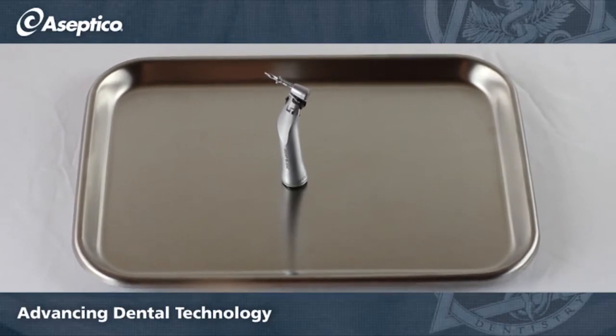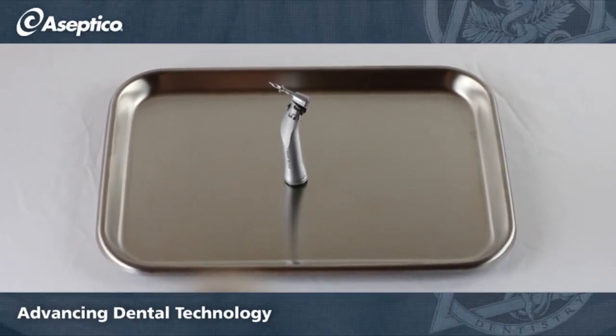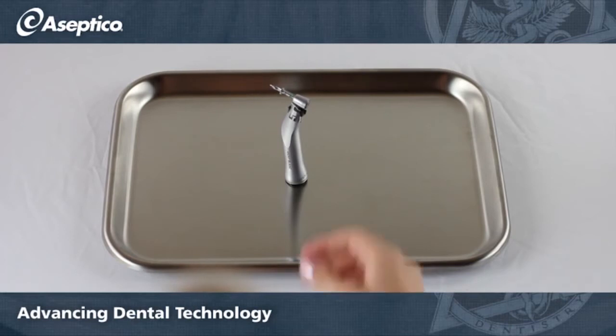Here we are going to show you how to quickly and easily disassemble and reassemble Anthejur's 20-to-1 Mont Blanc handpiece.